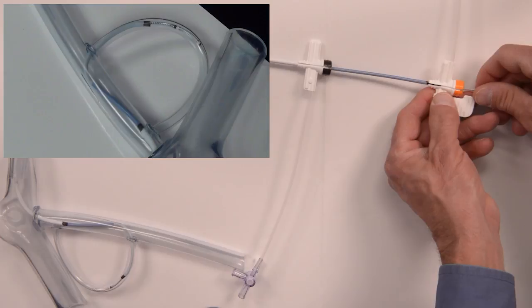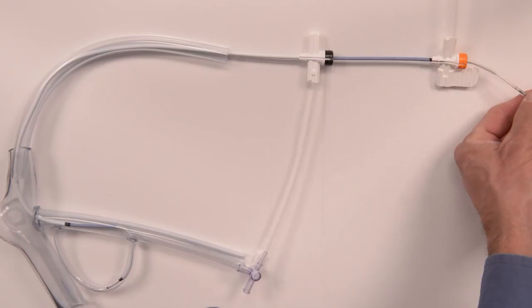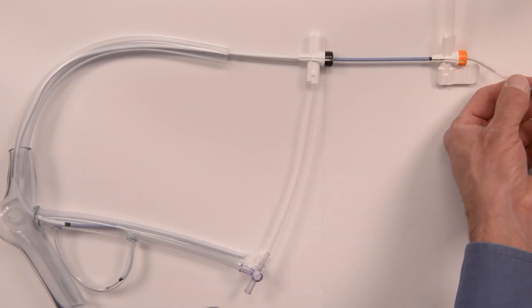At this point they'll test the lead, make sure all the numbers are good, the thresholds are fine, there's no phrenic stimulation. We have our pacing lead in a posterior lateral branch of the coronary sinus in a great position. We're going to replace the wire and put in a stylet or finishing wire all the way to the end to give some stability to the lead right before we slice away the LVI.